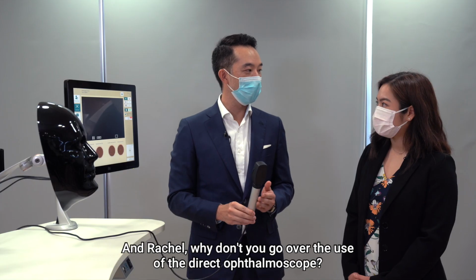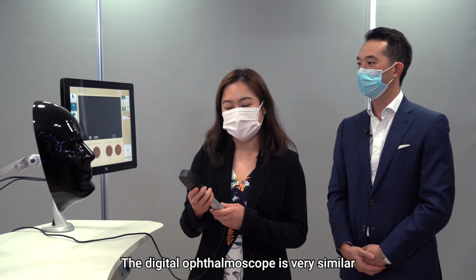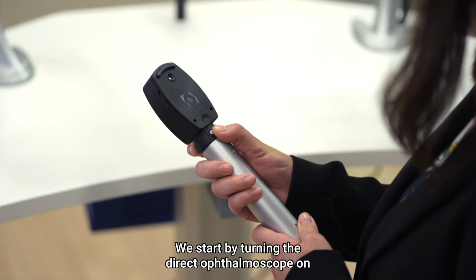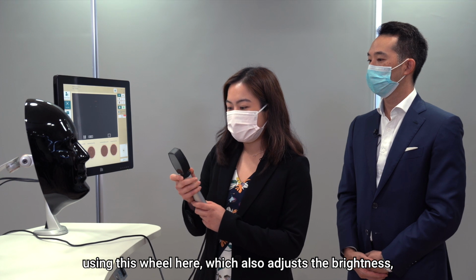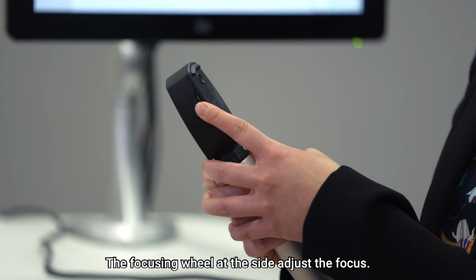And Rachel, why don't you go over the use of the direct ophthalmoscope? Sure, thank you, Dr. Fong. The digital ophthalmoscope is very similar to the real direct ophthalmoscope that we use in clinics. We start by turning the direct ophthalmoscope on using this wheel here, which also adjusts the brightness, which you will later be able to see on the screen. The focusing wheel at the side adjusts the focus.